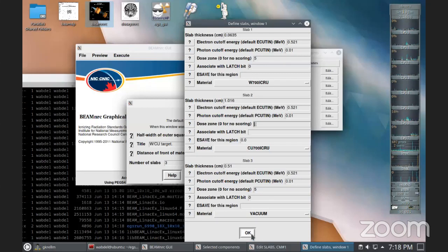Okay, so this is the first step because I got a question in the group. Okay, what's the output? Someone plotted that file. There were regions and there was a dose. So what was that big plot? I think in the output, I forgot to actually remove these dose zones, but basically that's the output. If you go, for example, to 13, you will find a dose there. Somewhere in this linear accelerator, there is a region that is identified as dose zone 13. I don't know where that is, so you have to look into the input file and see where it is, okay? Clear so far?